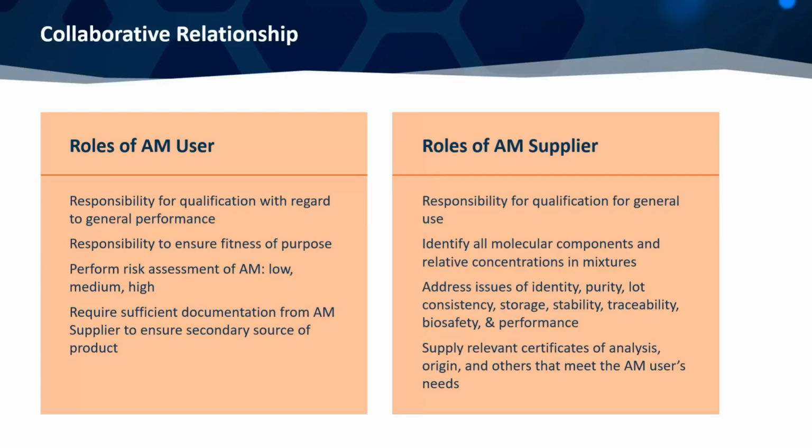I won't spend a lot of time on this slide other than to say that there should be an interaction if you really are developing, especially a clinical procedure to isolate cells. And the important thing for the supplier, as I've shown you in this presentation, is to identify all the molecular components and why it's important to have certain characteristics of your collagenase. They have a reproducible ancillary collagenase, ancillary material.